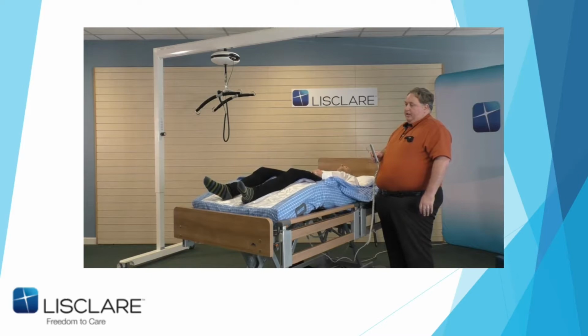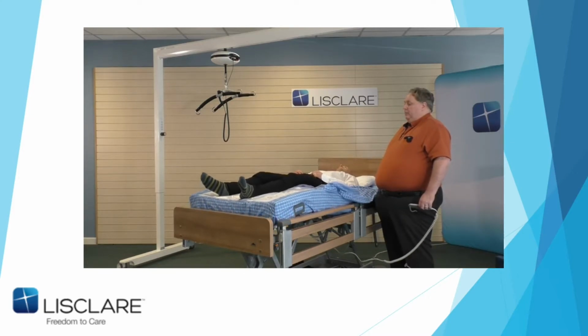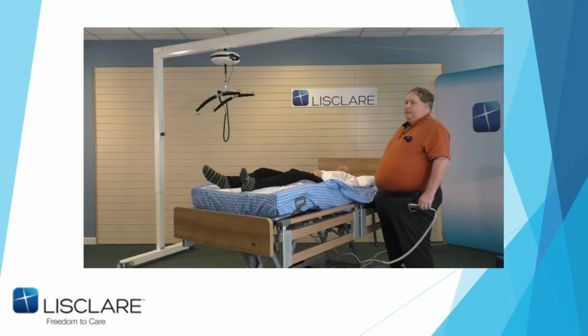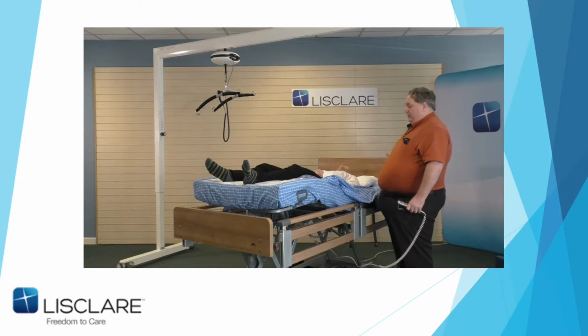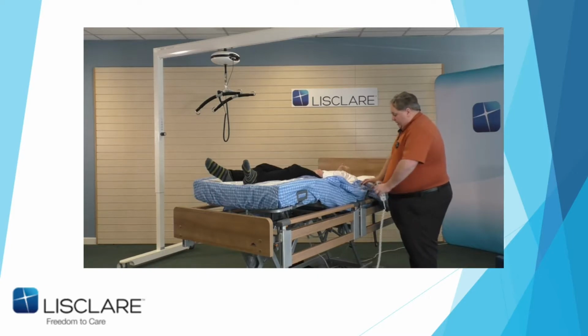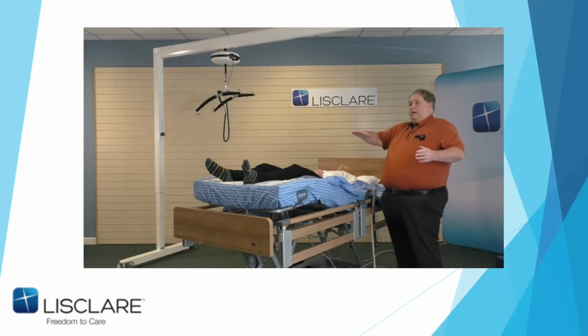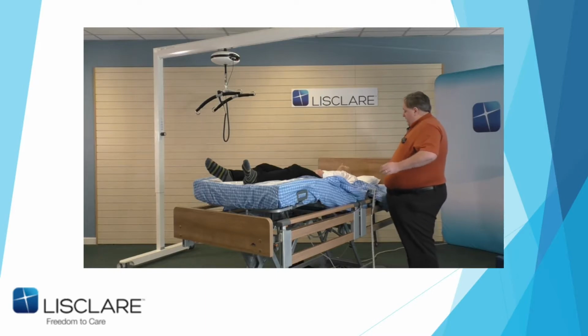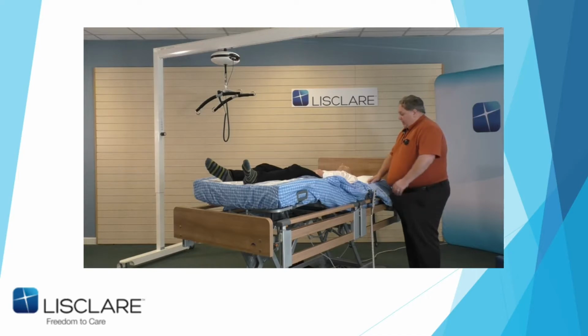Again, I'm going to do a cheat. Listen for three clicks. This works on most beds. There's the third click. So if I elevate that up, and hopefully you can see this with the camera angle, I've now created the slide back up the bed. And the reason why is this sort of situation is usually in the home, and you're not allowed to have a standard reverse Trendelenburg.